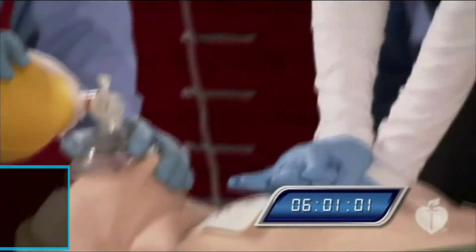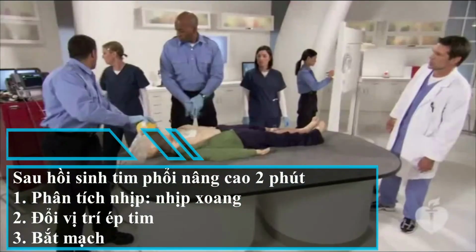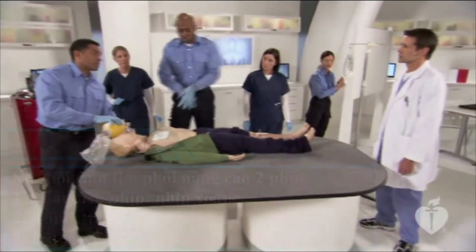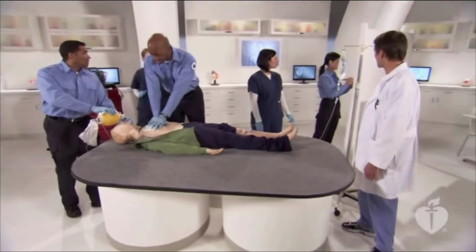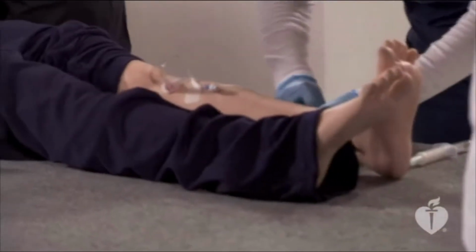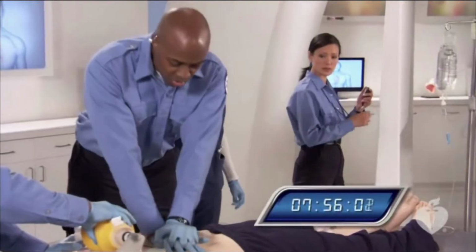2 minutes. Okay, let's analyze. Switch roles. Okay, the monitor shows sinus bradycardia. Do we have a pulse? I don't feel a pulse. Continue chest compressions. Continuing chest compressions. Shelley, how long has it been since our last dose of epinephrine? 3 minutes. Okay. Dana, let's go ahead and give 40 units of vasopressin. 40 units of vasopressin given. And the IO is flushed. Mandel, your compressions are slowing down. Can you pick up the pace a bit?